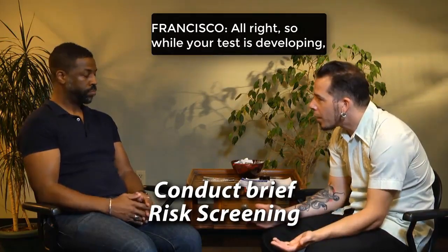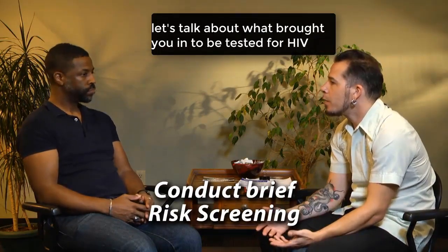So while your test is developing, let's talk about what brought you in to be tested for HIV today. Well, this past weekend, I met a guy online, and we ended up hooking up. We used condoms at first, but then we didn't. So I'm a bit nervous and just want to make sure I'm okay. Yeah, I hear you. So you met a guy online, ended up having sex with him. Sometimes you guys use condoms, sometimes you didn't, and you want to check in around your health.